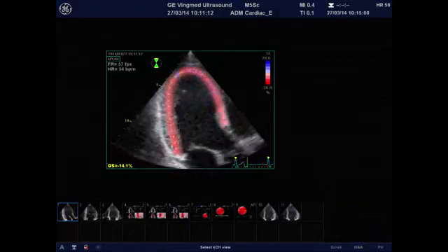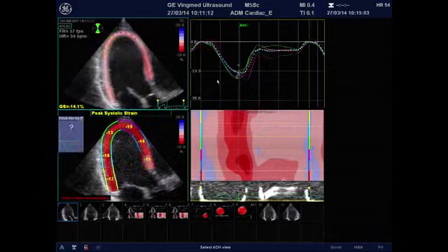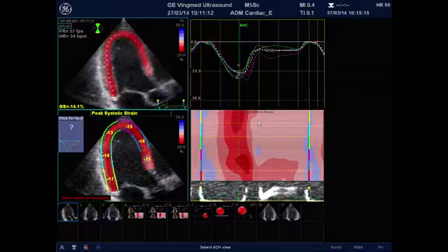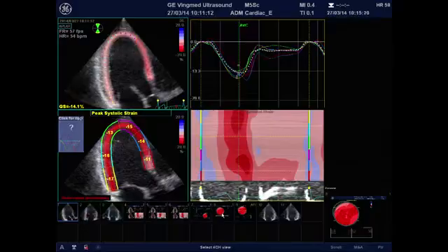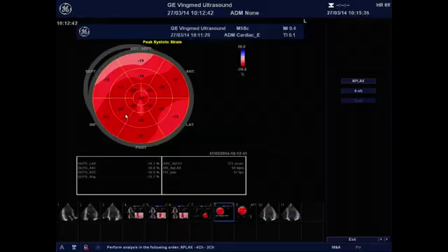You can look at the curves. You can look at the individual curves. In this case, during systole, all the different segments of the patient deform, shorten well during systole. And also relaxation looks normal. If you do this for the 3 views, 18 segments, you can construct a bullseye which gives you the information on the regional function, longitudinal function of all of these different segments. So this is how you optimize your image for speckle tracking and how you do the post-processing.